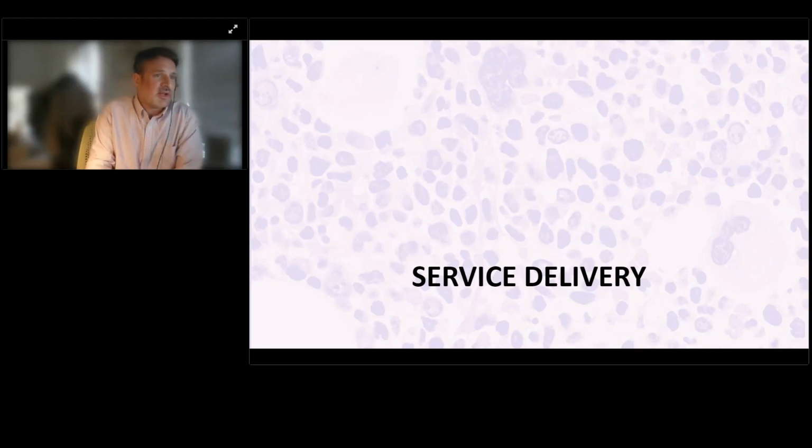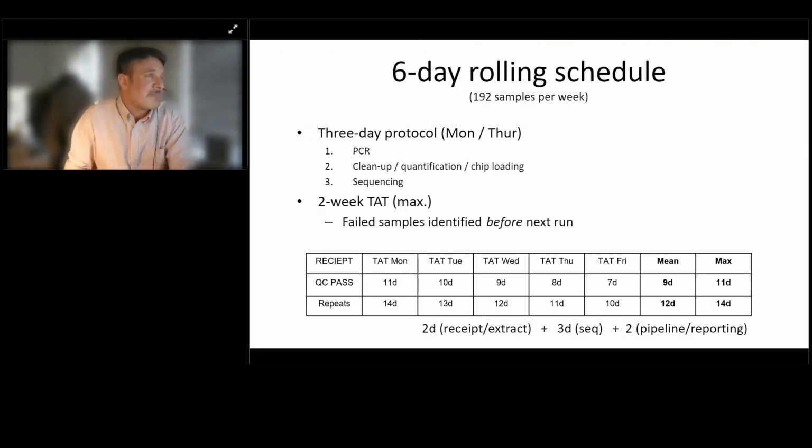So I'll just move on quickly now to talk about, in the last few minutes, the design of the service for the patients. As I said, we're looking at approximately 200 samples a week, and then a little bit of the audit data that we've got.